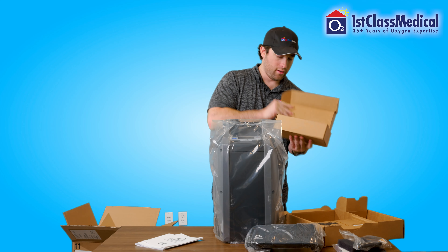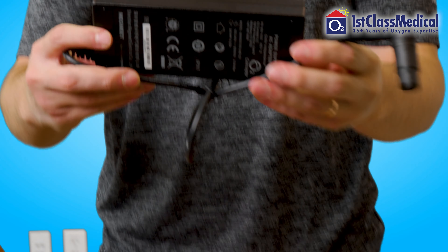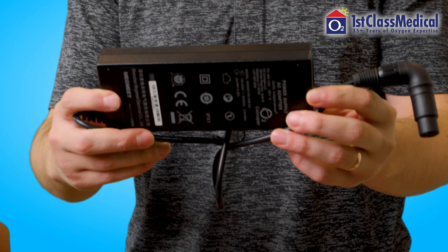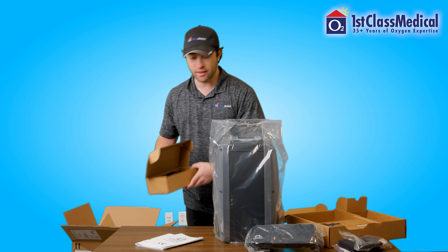In this box, you're going to find an AC power supply. This AC power supply is what you're going to actually use to plug the unit into the wall. You can use the unit and charge the battery at the same time while the unit is in use.